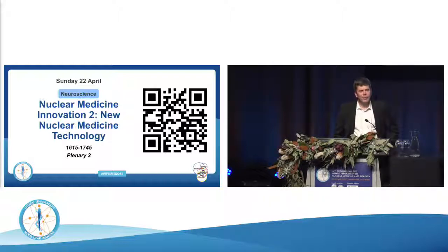So Otto's question relates to whether we always need to reduce the data back to sinograms, particularly as we go to these very extended field of view systems with very large numbers of lines of response. Certainly, in these systems, the number of lines of response start to exceed the number of events by some considerable factor. So in almost all cases, you're going to be doing list mode-based reconstructions. You're not going to be creating sinograms. Doesn't make sense anymore.